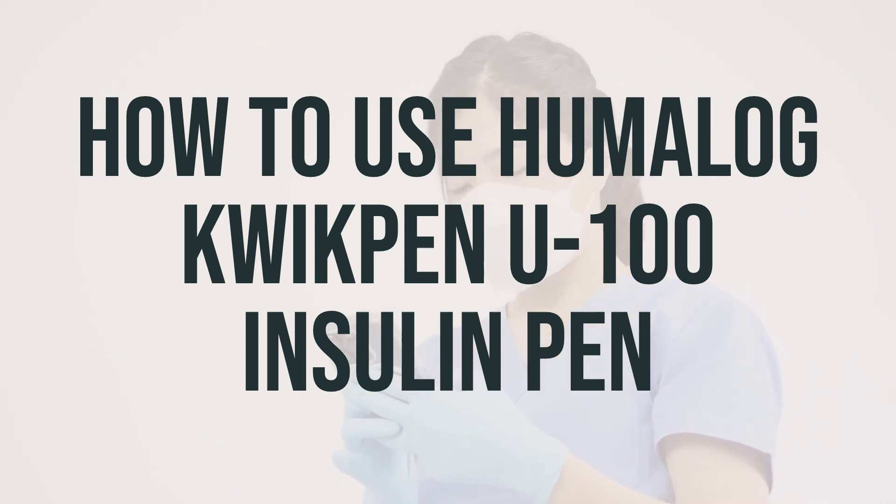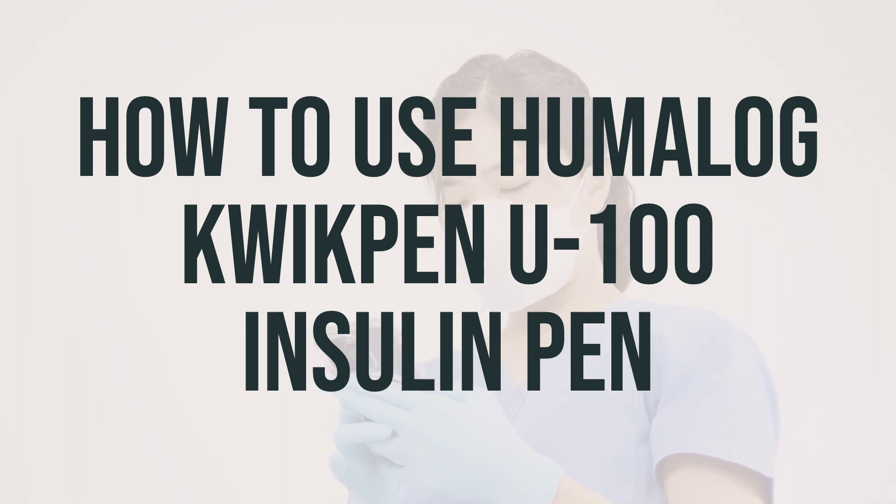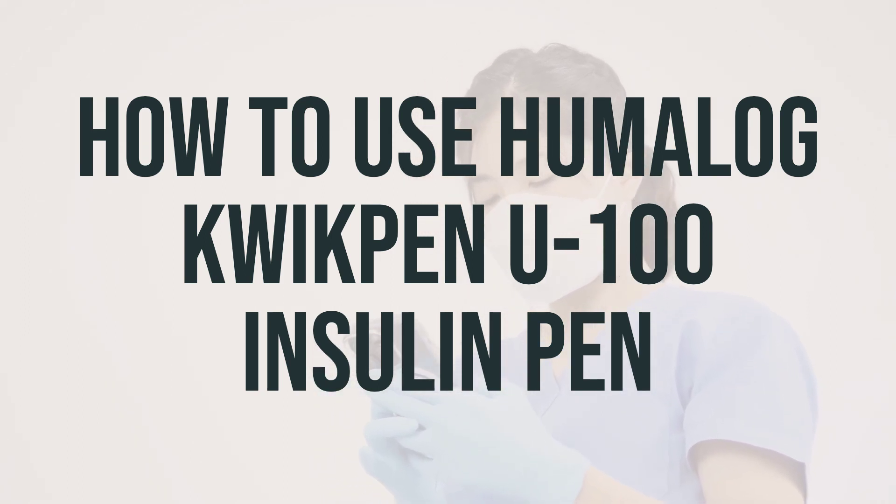Before using the insulin, check it visually for any particles or discoloration. If you see any, do not use it. Clean the injection site with rubbing alcohol before injecting each dose. Change where you inject each time to lessen the risk of problems under the skin. You can inject the insulin in the stomach area, the thigh, the buttocks, or the back of the upper arm.